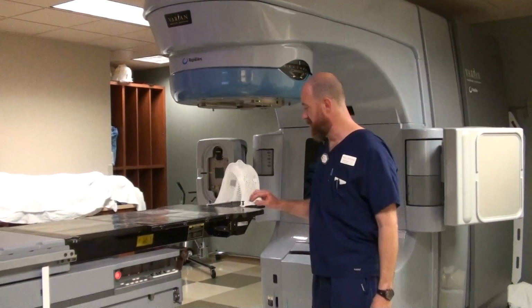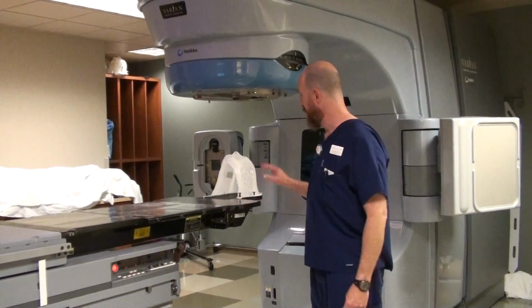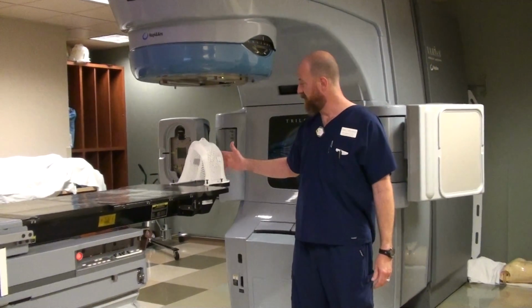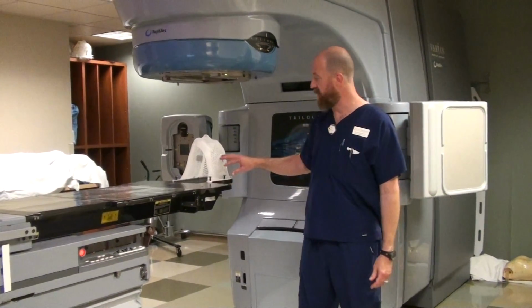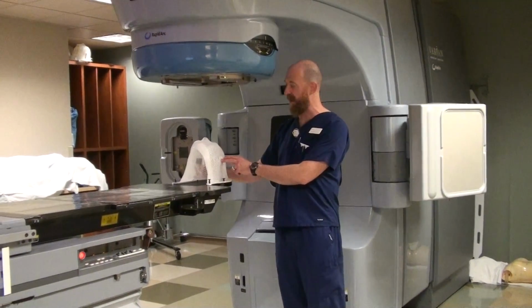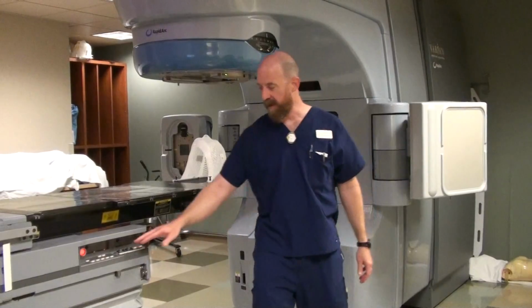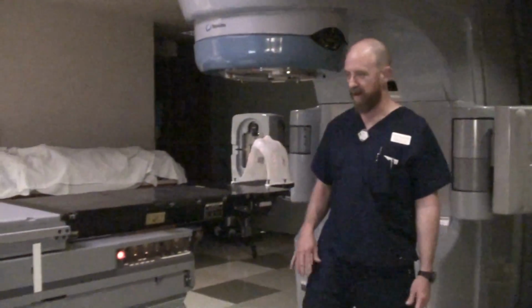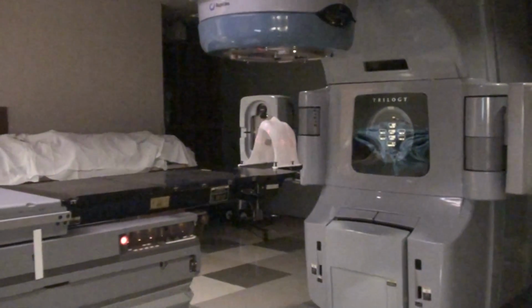So we're going to talk about whole brain treatment. Normally, the patient will have a mask. Normally, it'll be a three-point setup. You're going to use your side lasers to line the patient up on the left and right lateral. You'll get 100% on with your laser on the side of the mask. I'm going to walk to the other side of the table.